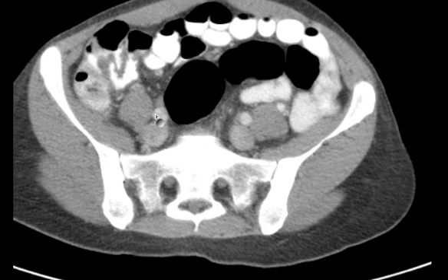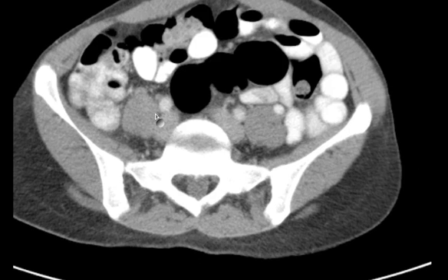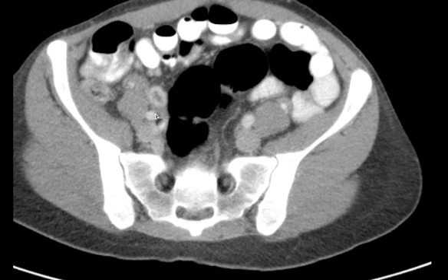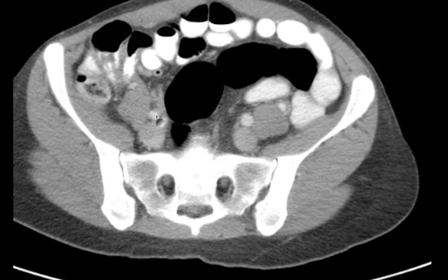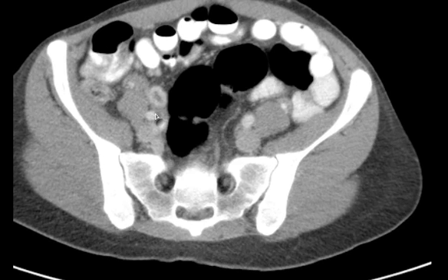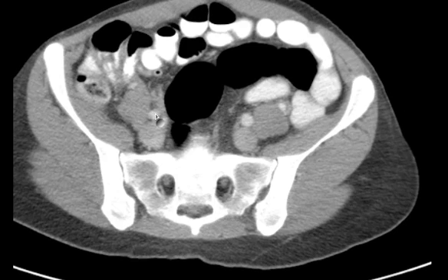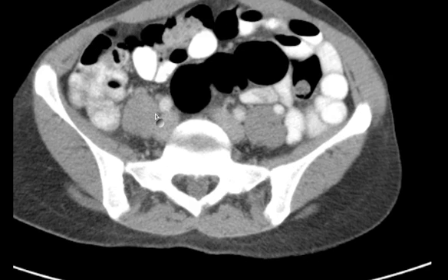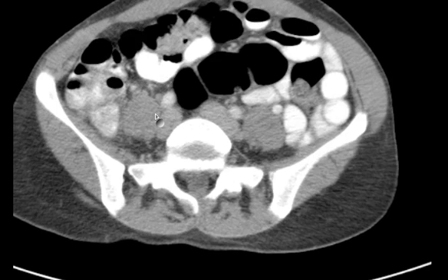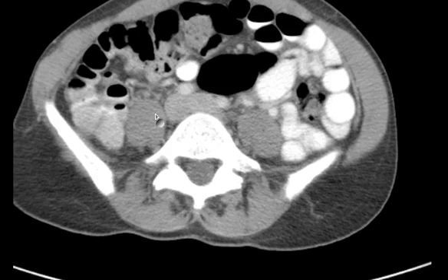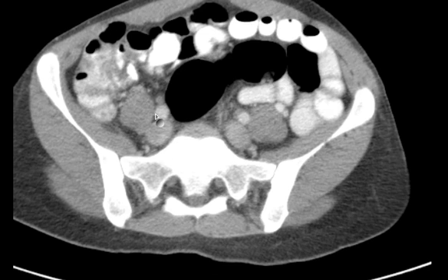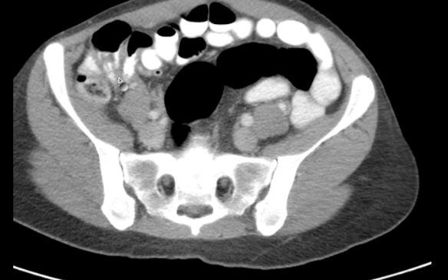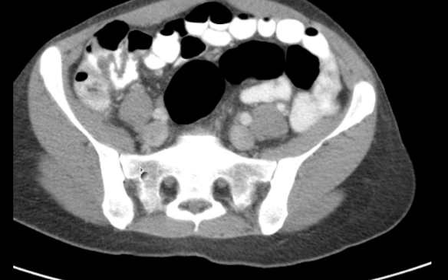And then you can see right here the appendix. Watch that as we go up and then follow it down. Now remember, the rule of thumb for finding the appendix is to first find the ileocecal valve — that's right here. You can see small bowel coming in there.